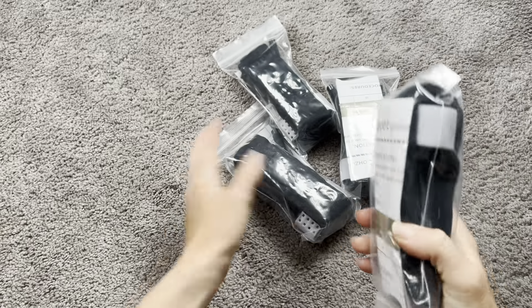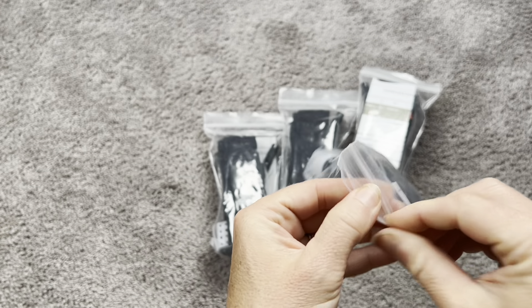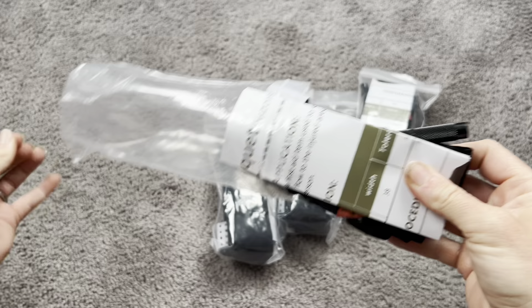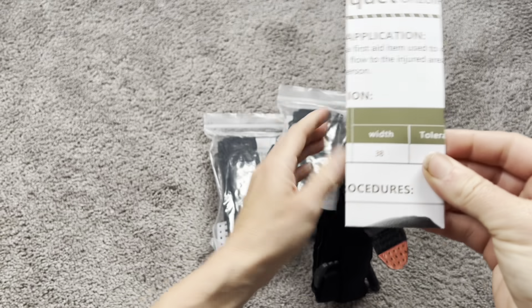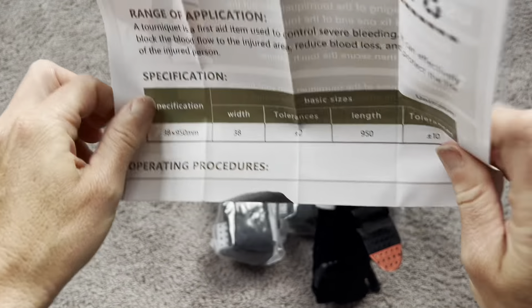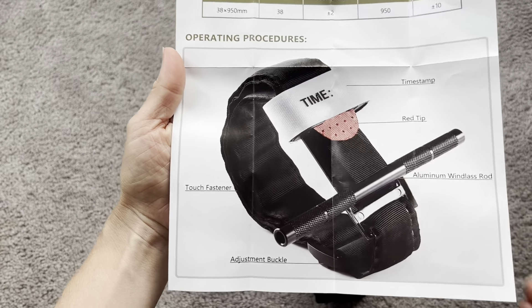Today I am checking out these tourniquets — emergency tourniquets that are really good to have pretty much anywhere: in your house, in your car, or with you if you're going on a hike or in a dangerous situation, because these are going to really help you in case of emergency. There's a total packet right here that tells you all about the tourniquet and how to use them.